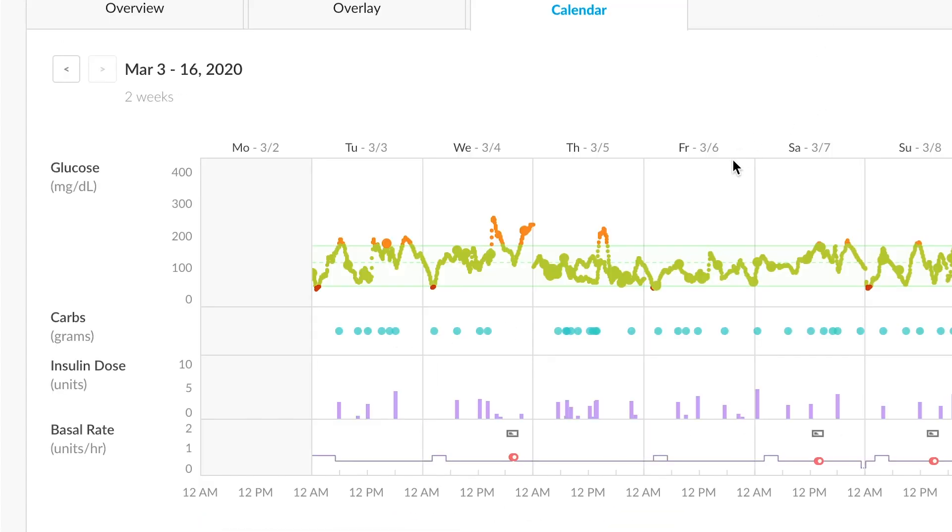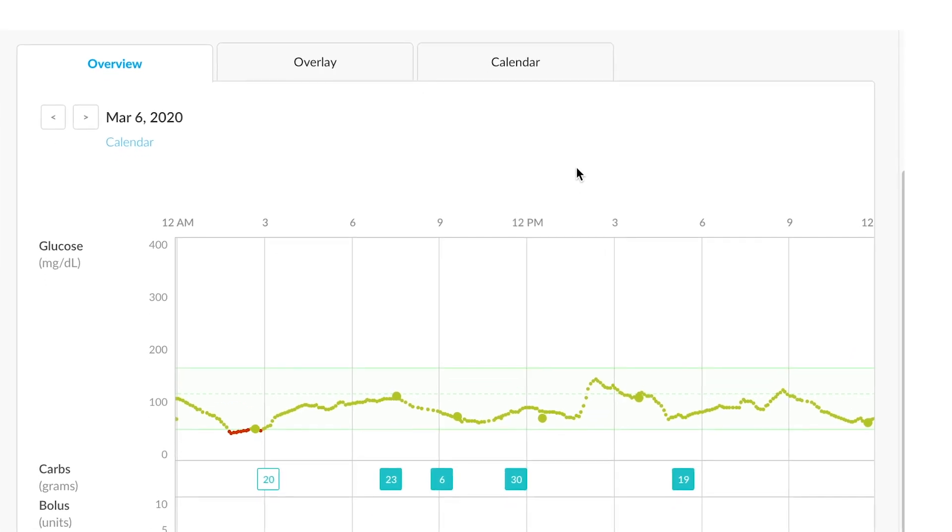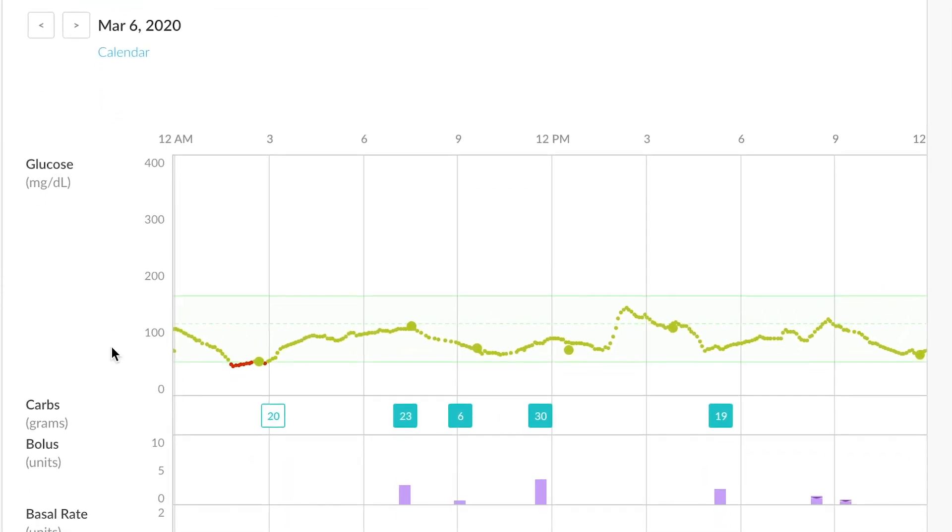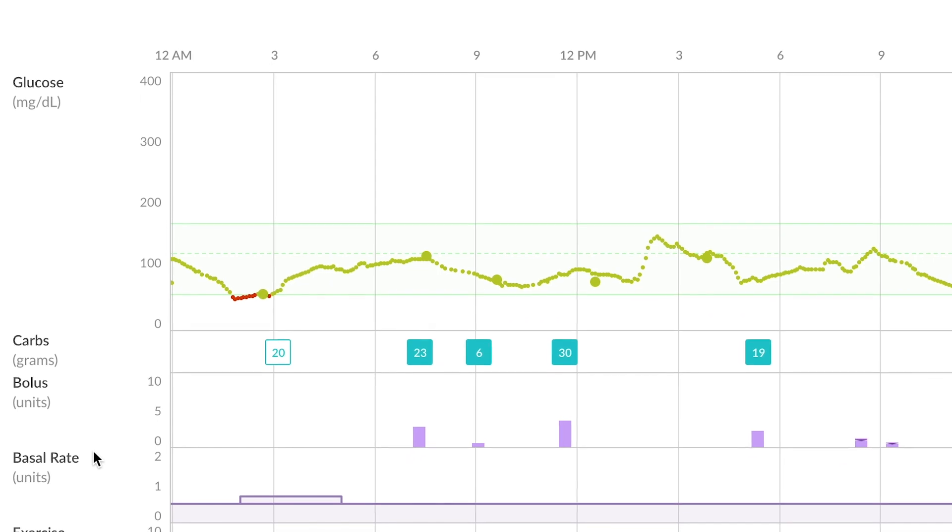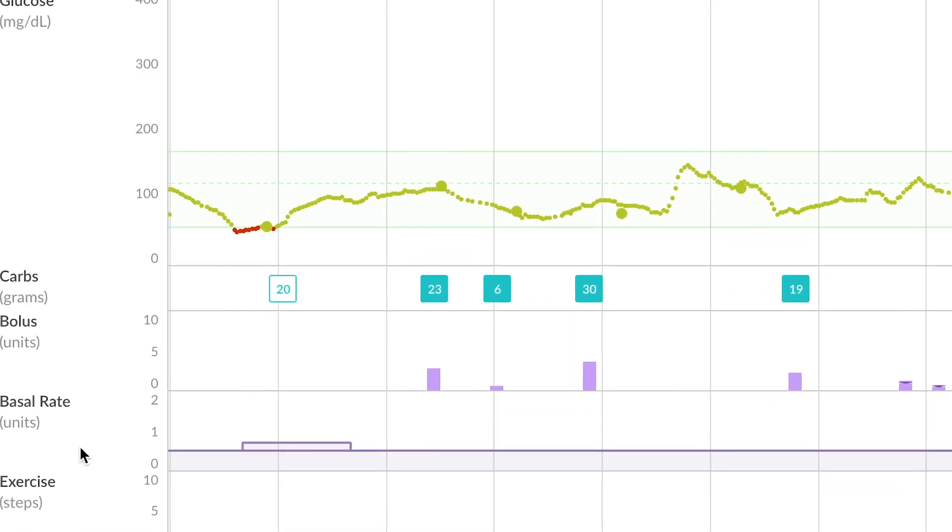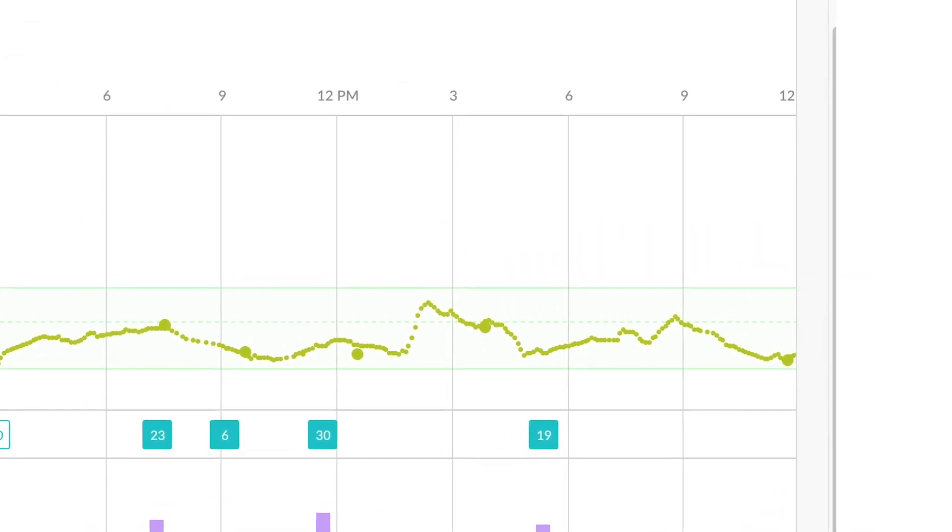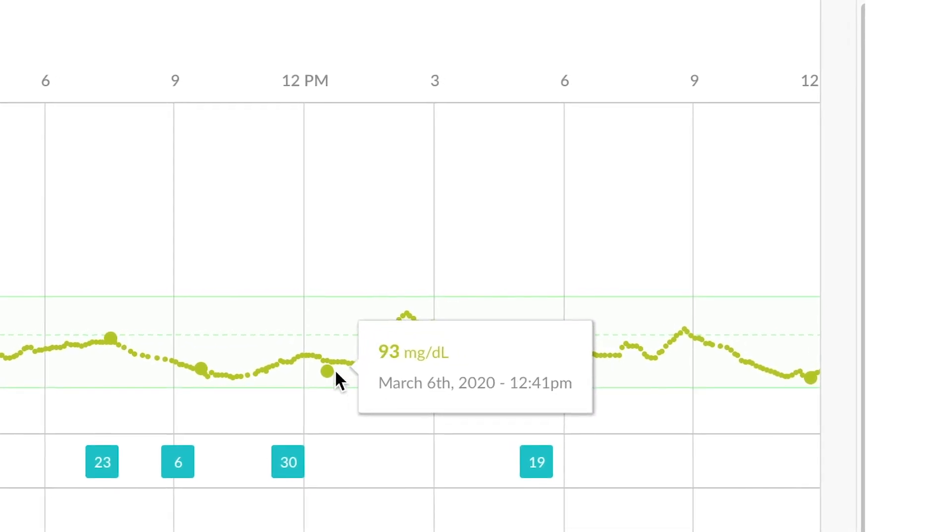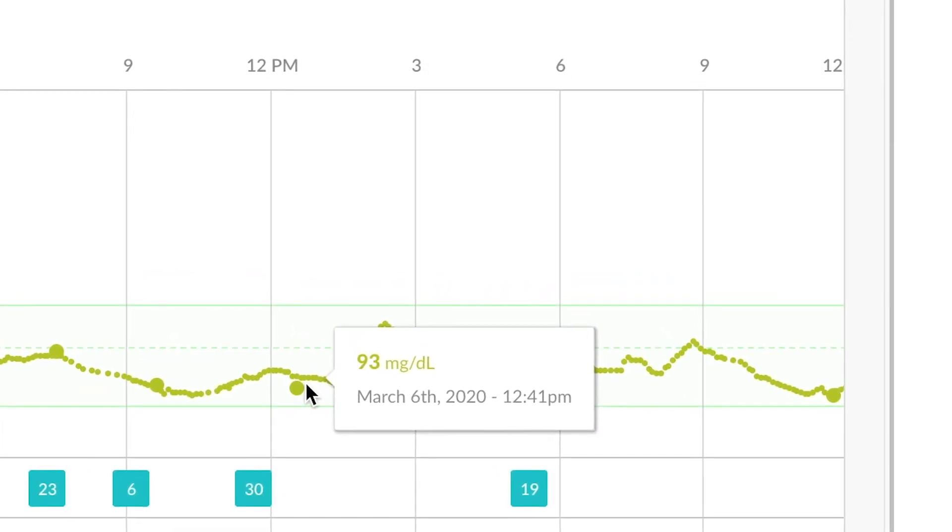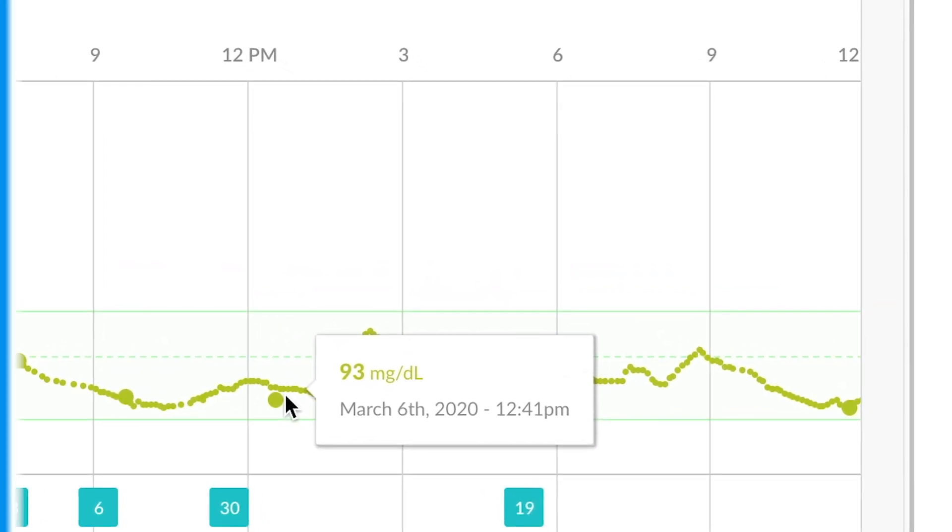Clicking on any one section in the calendar view will actually take you to an overview of that day. This can be a great view to compare glucose, carbs, bolus, basal, and exercise data all in one easy place. Hovering over any one data point in the graph will display more information. For instance, here's a 93 blood glucose value.